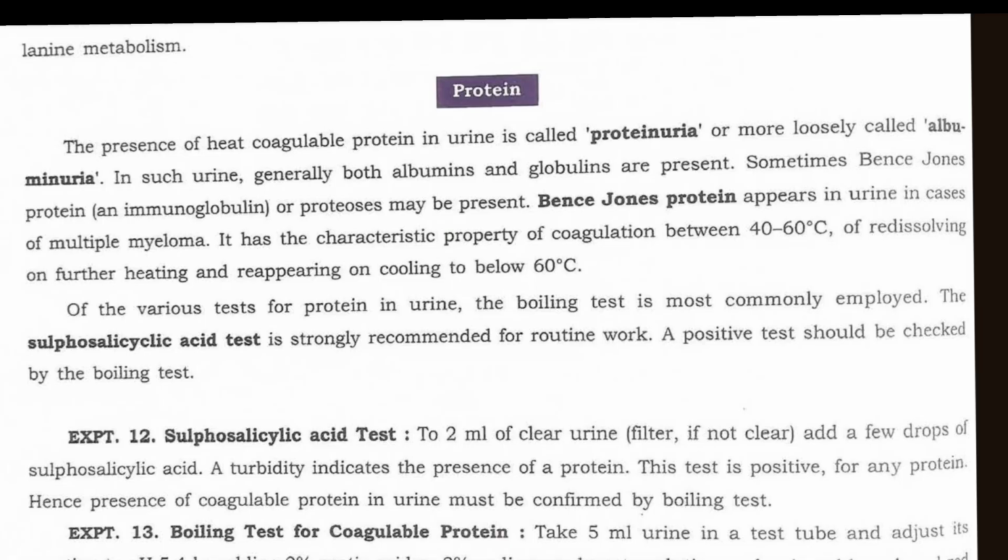Bence-Jones protein appears in urine in case of multiple myeloma. It has the characteristic property of coagulation between 40 to 60 degrees Celsius, of redissolving on further heating and reappearing on cooling to below 60 degrees Celsius.